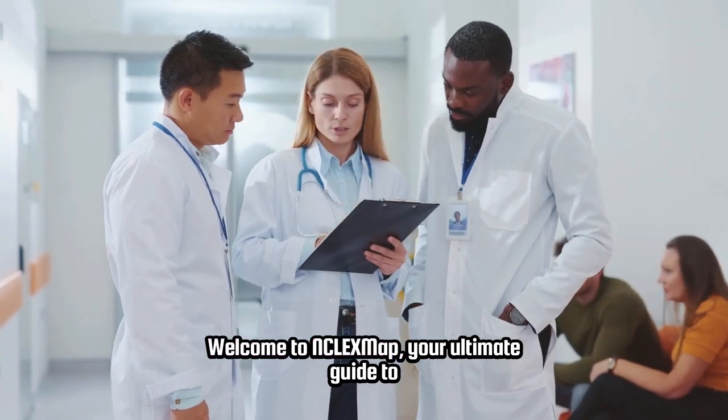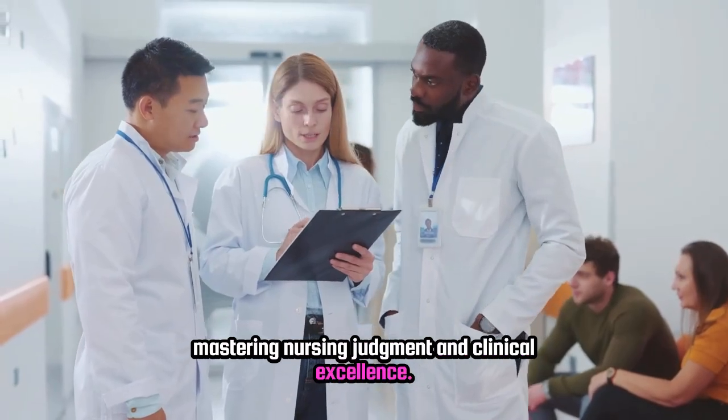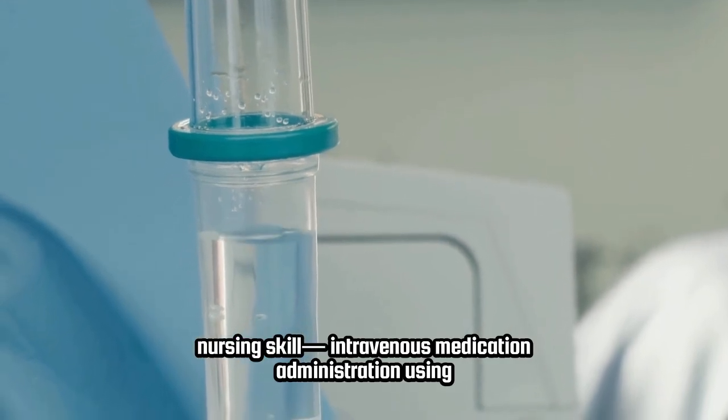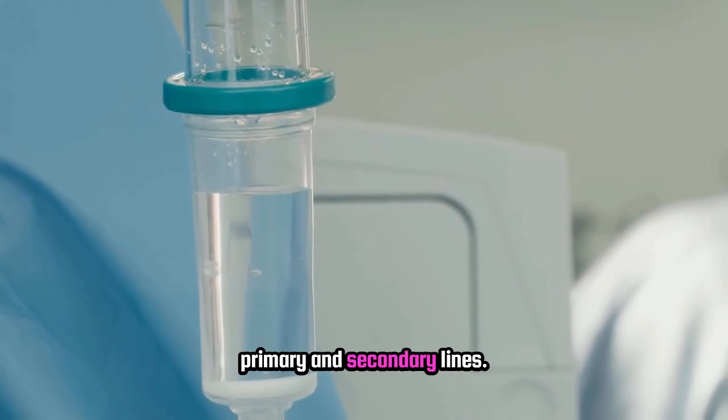Welcome to NCLEX Map, your ultimate guide to mastering nursing judgment and clinical excellence. Today we're diving into a vital nursing skill: intravenous medication administration using primary and secondary lines.